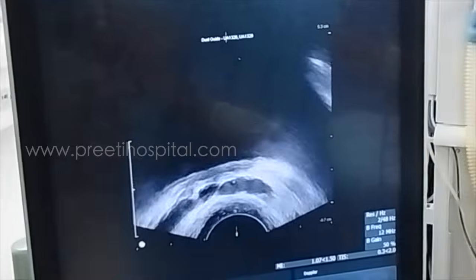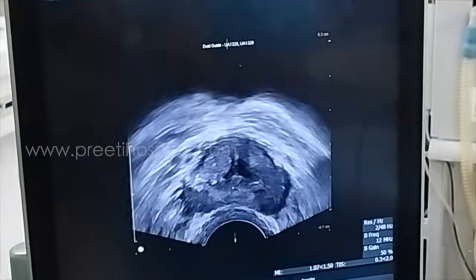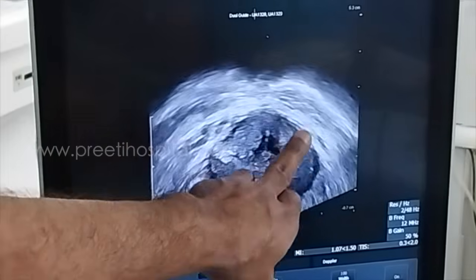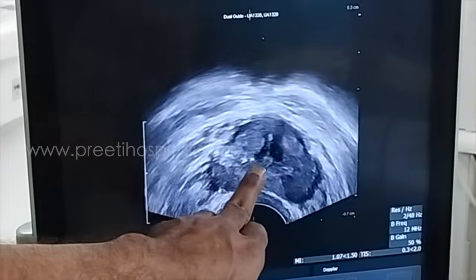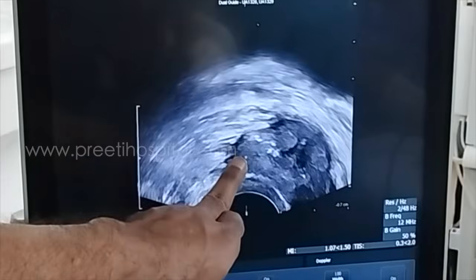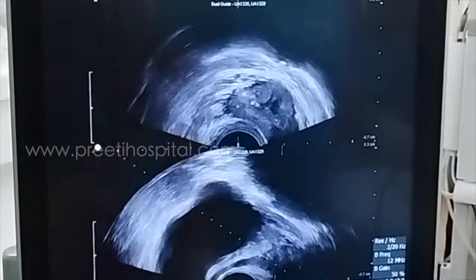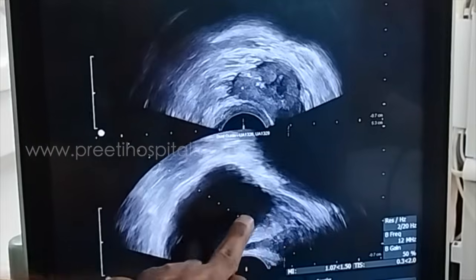Yes. Come back. You have to rotate for that. No, I'm just coming back. This is the base region. In this base region, if this needle goes to this side, that is the right side, lateral. Now in this plane, can we see in sagittal? Yes, both. Now this is biplanar, sagittal. Yes, biplanar at the base.